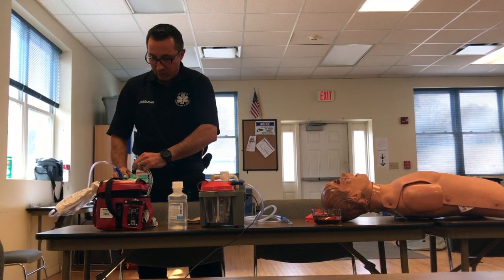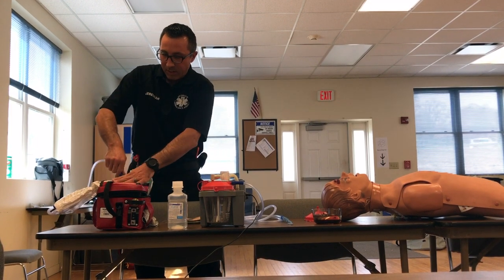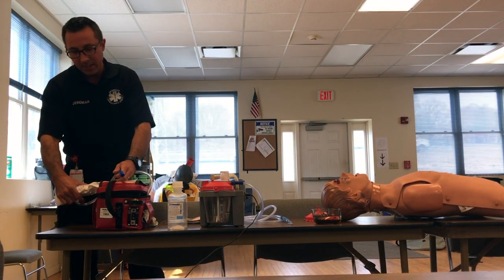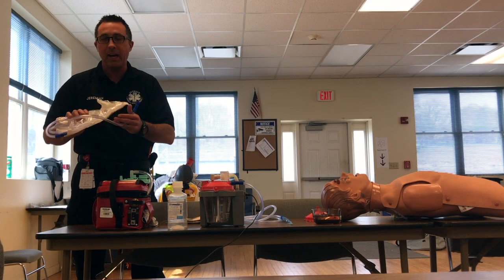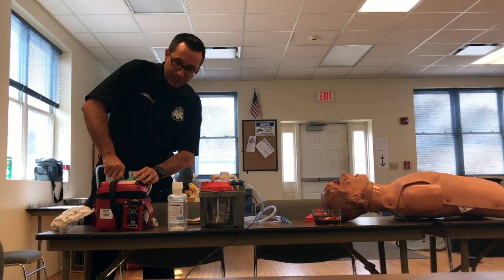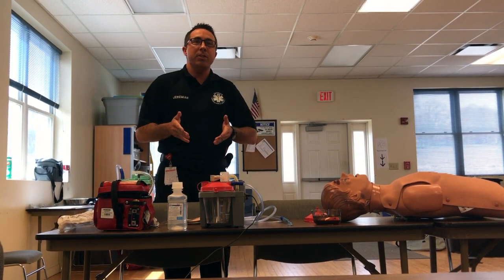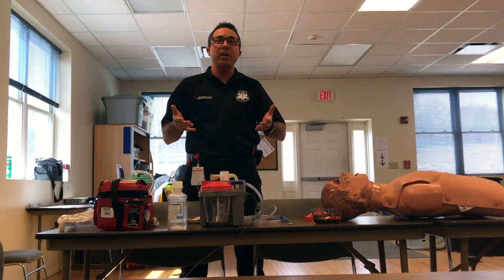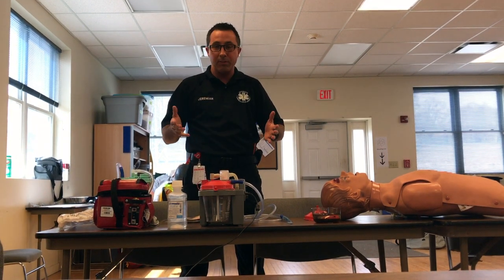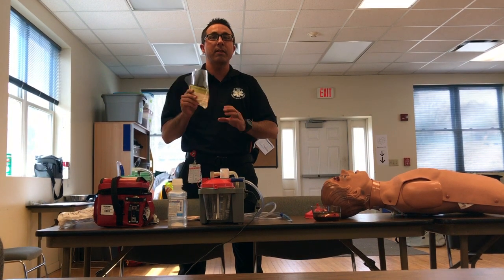So this tubing here is going to attach to the center hole, which is the vacuum hole. This tubing here is connected to my suction catheter, and that's going to go on the barb fitting that says 'patient.' Any time you're suctioning, you want to make sure that you're wearing the appropriate PPE or BSI — gloves on, and it's not a bad idea to have a face mask and eye protection.